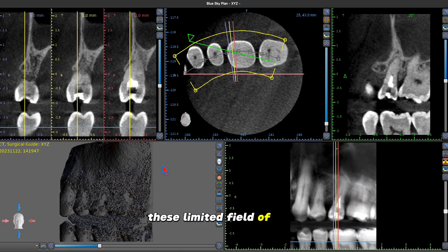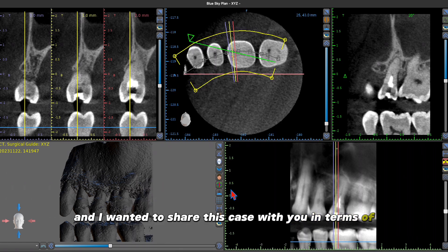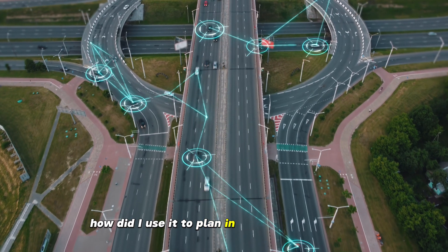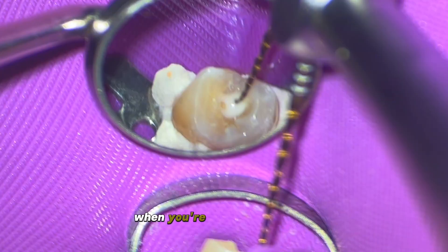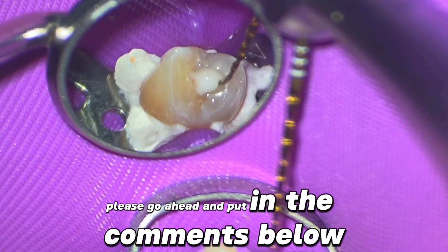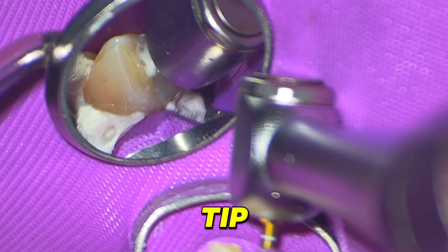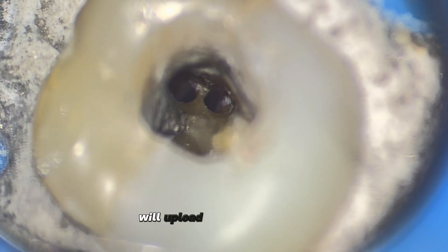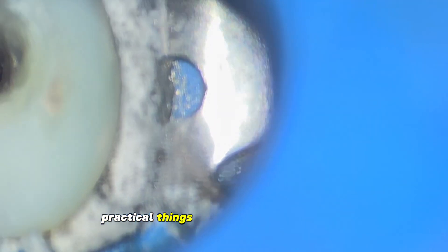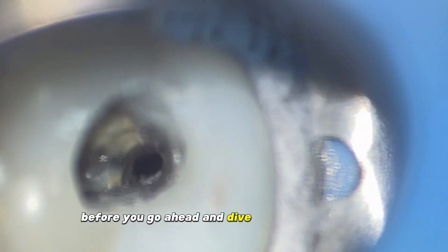These limited field of view cone beams can be such a lifesaver, and I wanted to share this case in terms of how I used it to plan in advance. I'll go over a couple of things, and if you have extra tips you look at when using a cone beam, please put them in the comments below. Stick around to the end of the video because I want to talk about one specific tip you need to know to prevent file fracture. In the next few uploads, we'll look at a maxillary molar and potentially a mandibular molar — practical things you can write down and take pictures of before you dive into that root canal.